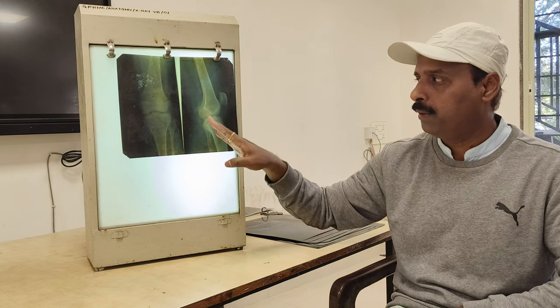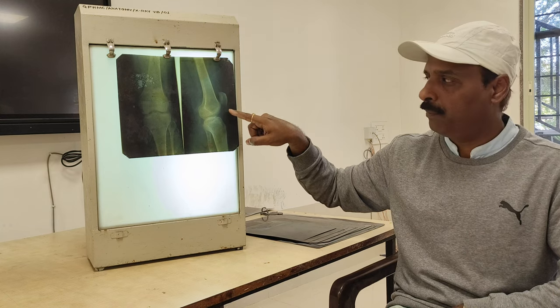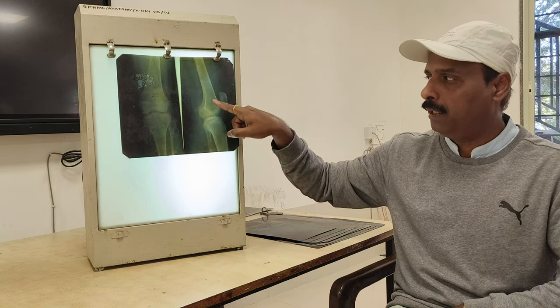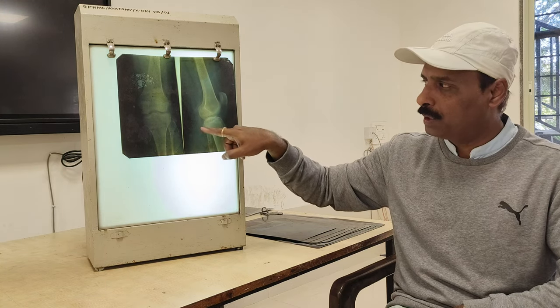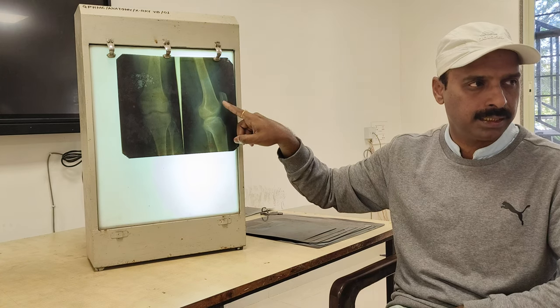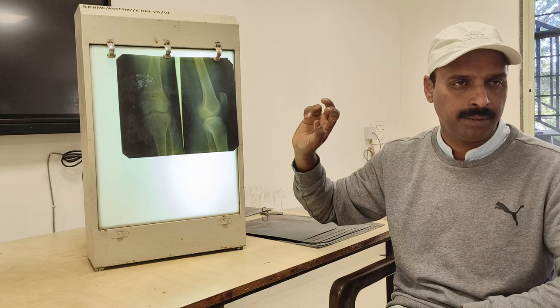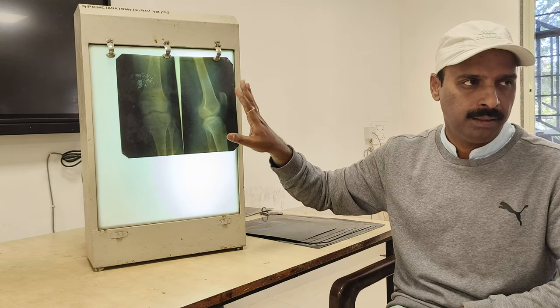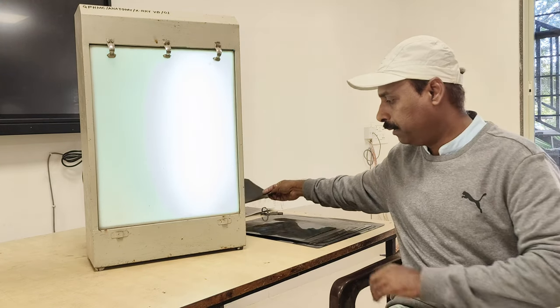So this is the one you have to remember. Including the bony part articulation, we have the patella, then we have the tibia and fibula and the lower end of the femur. Very important, you have to remember. Again, you have the soft tissues and ligaments, which are seen as blurred shadows around that. That is not much important when you get the joint. So this is the x-ray of the knee joint.